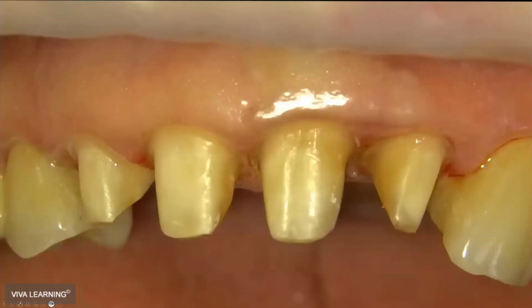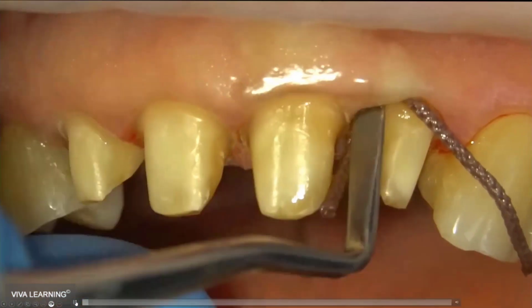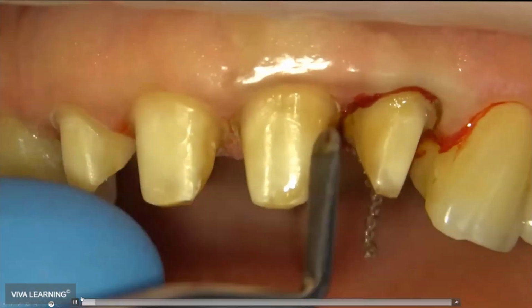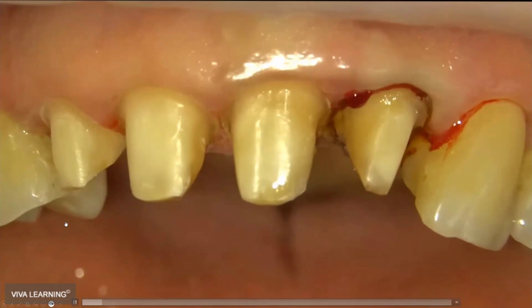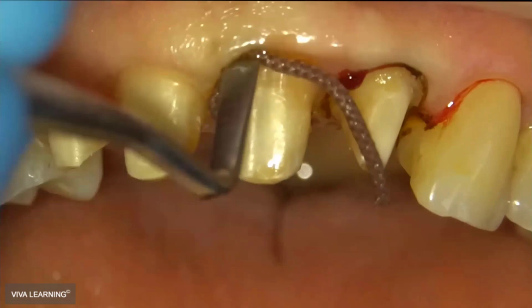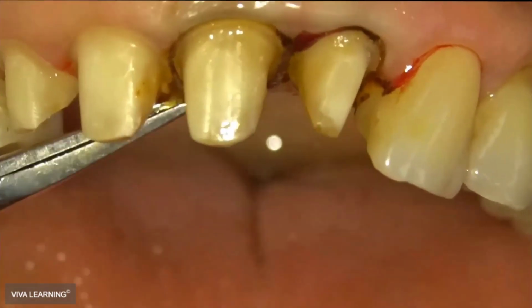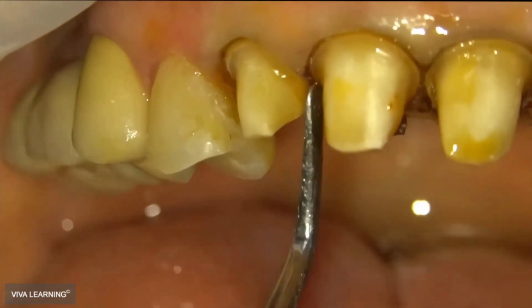This is another case. The patient wanted to improve the smile. You can see it's a very difficult situation. We decided to make 4 lithium disilicate crowns. In this case, I decided to do a two cord technique, but in this case, I just placed the one cord to be able to prepare a little bit subgingival the margin of the crowns.